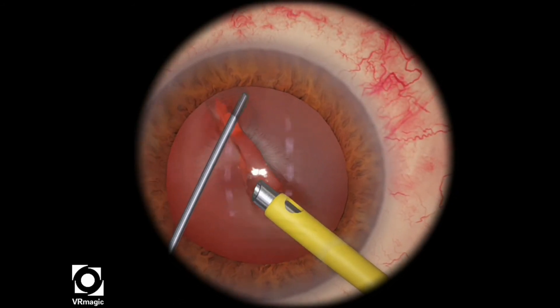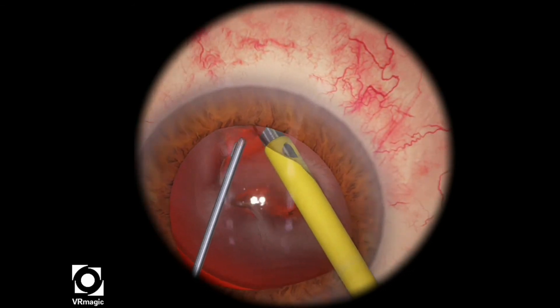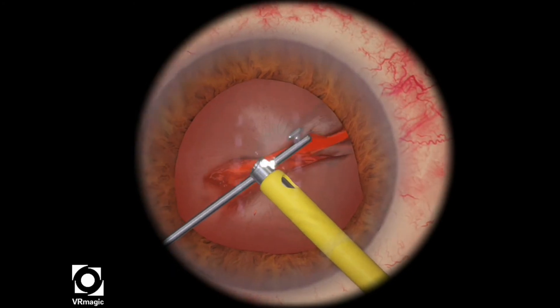Afterwards, I rotate the lens and see how soft and pliable it is, but you want your instruments deep inside that trench you just created, and then pull. And then you've created your crack.